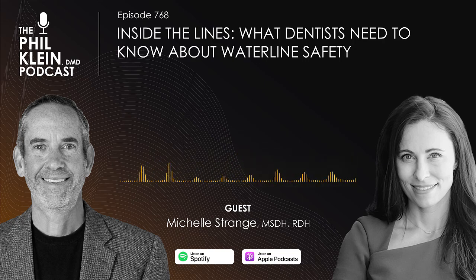What exactly is a waterline shock treatment? Tell us what that means, and when should a dental practice use this? So a shock is oftentimes either a different chemical than what you're doing to treat your lines every day, or a stronger version of it. I won't speak to all products, but I'd say that's a pretty decent generalization. What we're doing is trying to knock that biofilm down a little bit so that it doesn't have those seeds that will go out and start feeding and creating a bigger biofilm.